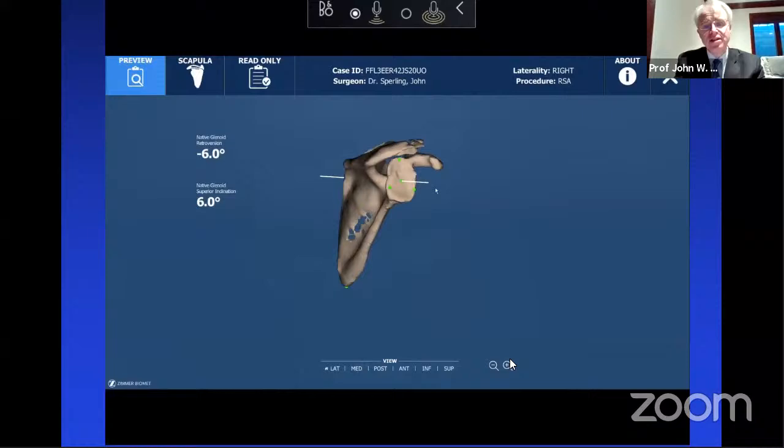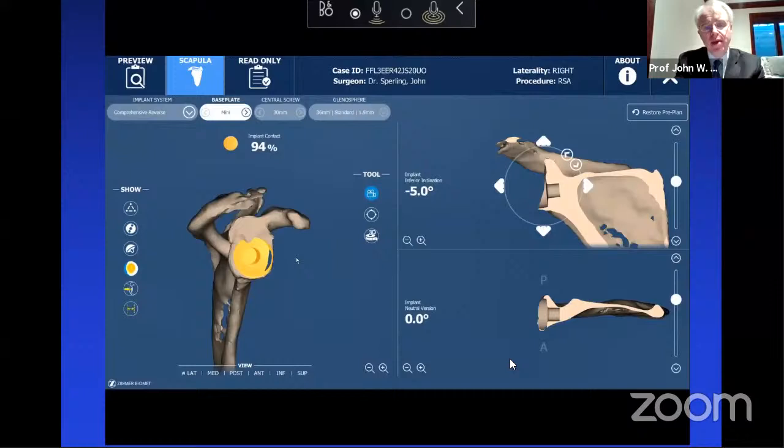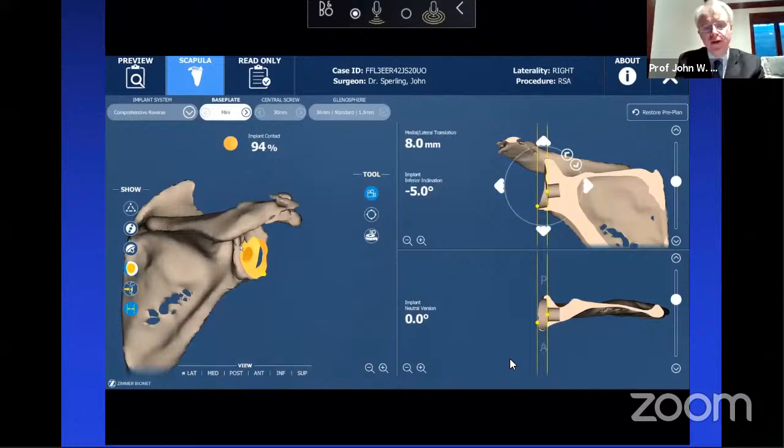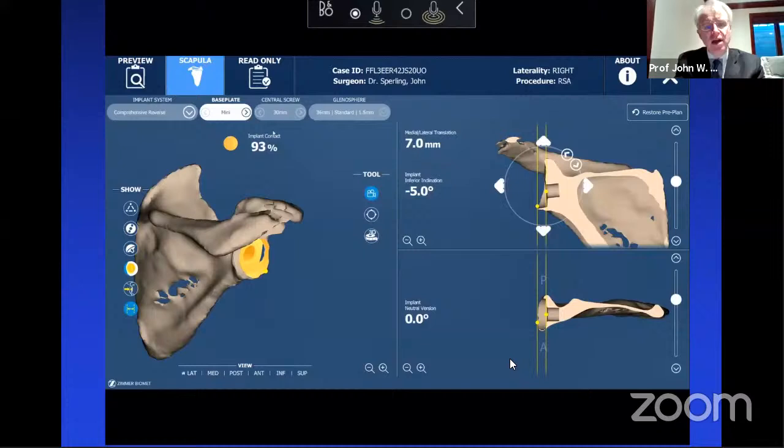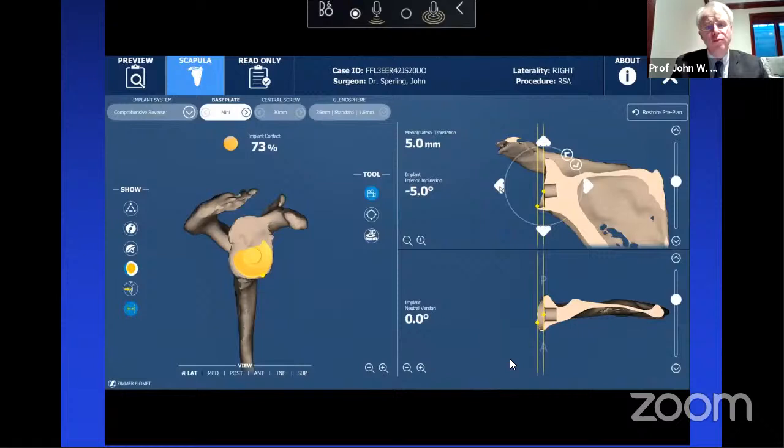And what we'll do now is to try to understand where should we place the base plate and what type of base plate should we place. So this is a standard base plate, a mini base plate. You can see the amount of eccentric reaming we're going to do in the central and inferior part of the glenoid to be able to go ahead and get our contact. And then I think, as I've learned from, again, my good friend Tom DeQuinn, through some of this research, what we'll do now is we'll start using augments to see if we can preserve more bone and preserve more lateralization rather than reaming away that bone.